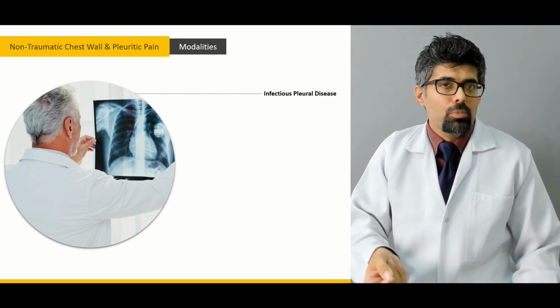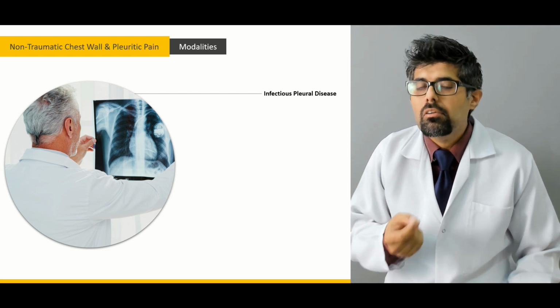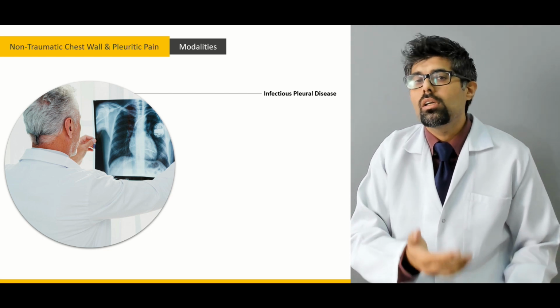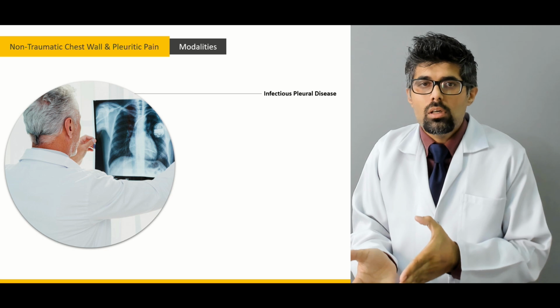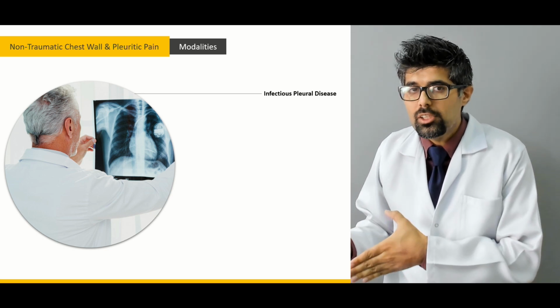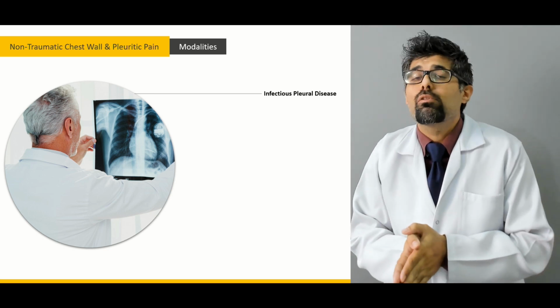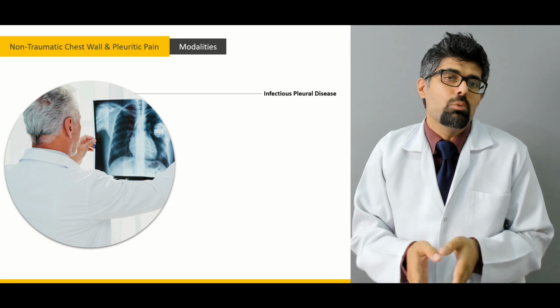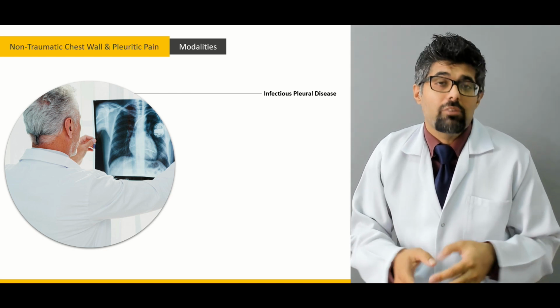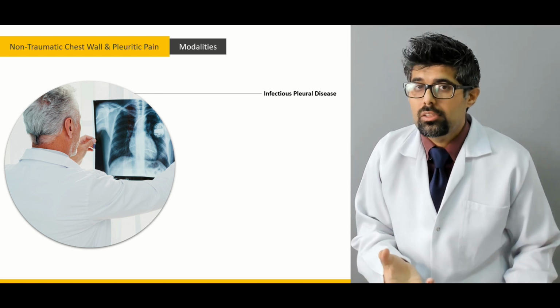Now, in case of pleural effusion, we have two kinds. Either it will have a meniscus, which is usually found in infection, and the pleural effusion is serous due to that infection. This kind of pleural effusion is usually found in pneumonia. The other kind of pleural effusion that we may find on the chest x-ray is the loculated type.